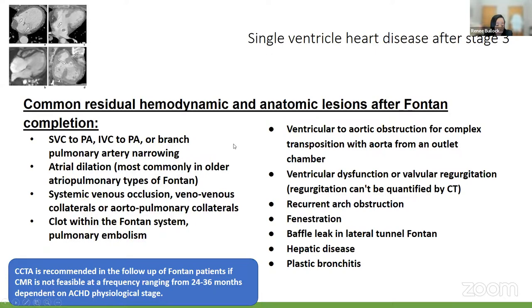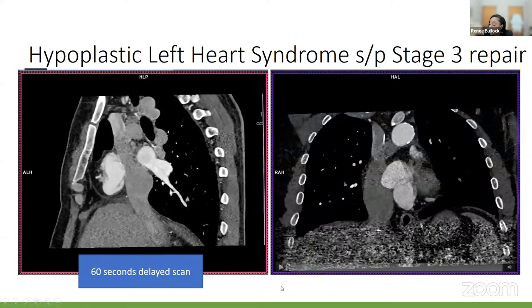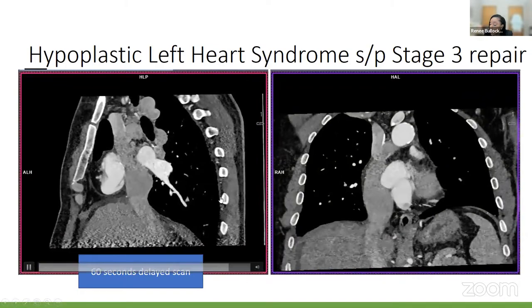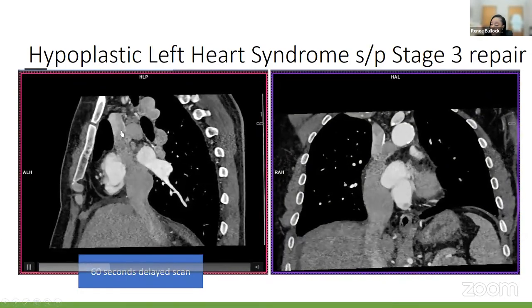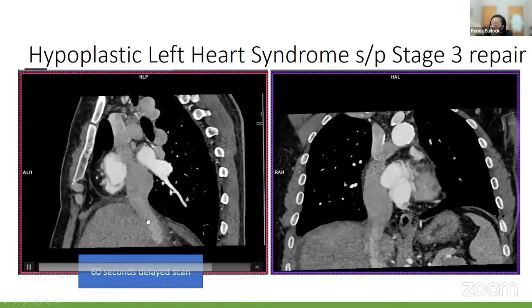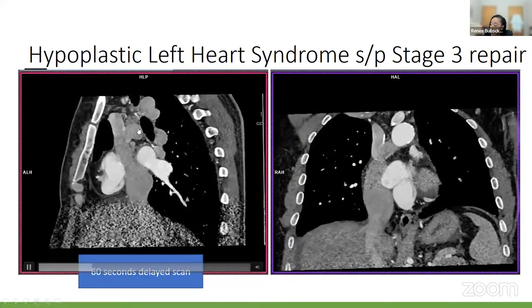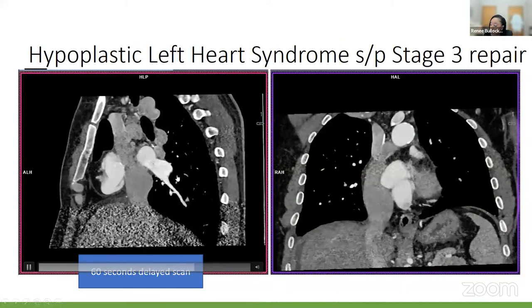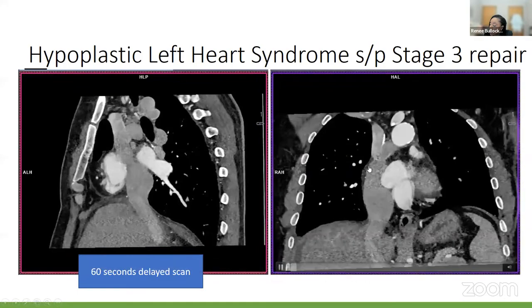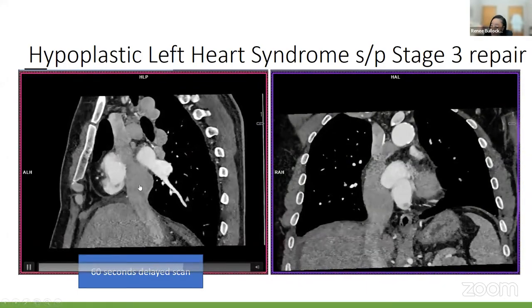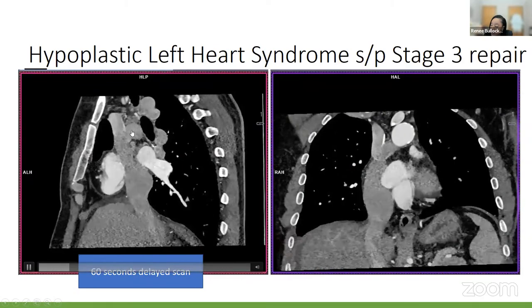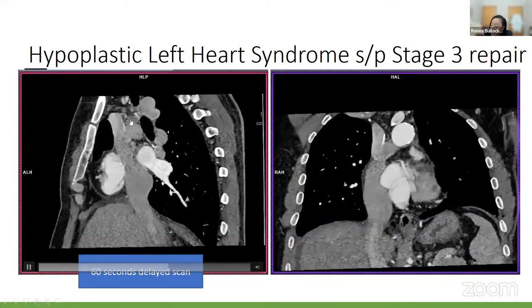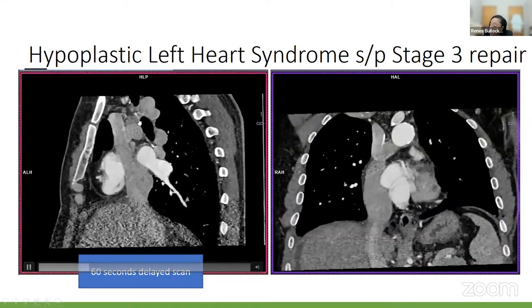For this group of patients, CT or CMR is recommended every 24 to 36 months to look for these complications. Here is an example from our CT suite — the Fontan conduit with SVC and IVC emptying into the pulmonary artery. The Fontan circuit was quite patent with no obstruction of blood flow, though there were some collateral vessels seen superiorly.